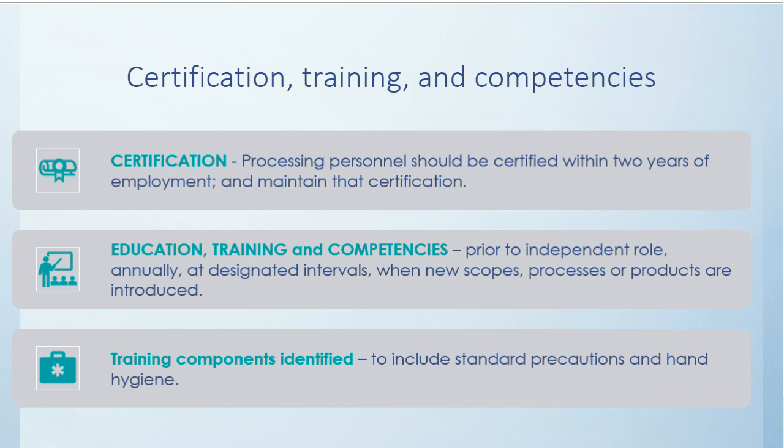Of course, if your state has anything that's stricter than that, then you would want to follow that. But some states don't have any requirements or recommendations for certification of technicians, so we wanted to make sure we address that.